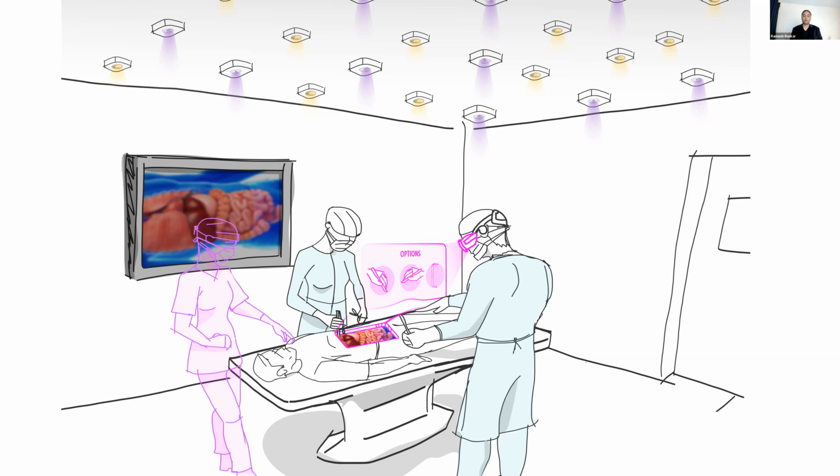The ceiling is made up of cameras and projectors and multispectral light sources. All the clutter of lights and interactions has been removed, so the surgeons can really focus on what they have to do. In addition, they can see options of what exactly the surgery would look like. Should I take option A or option B or option C? So what does this future look like?